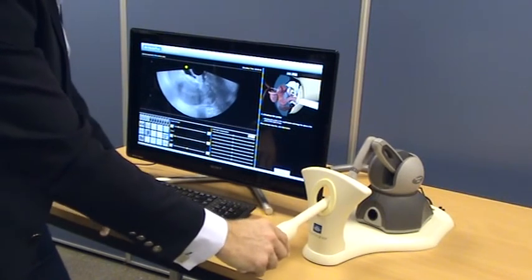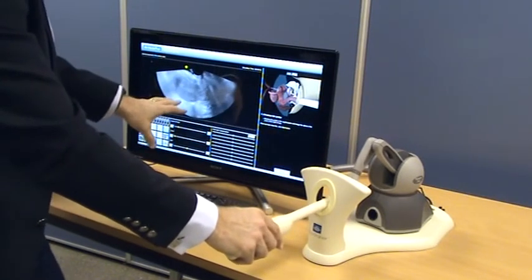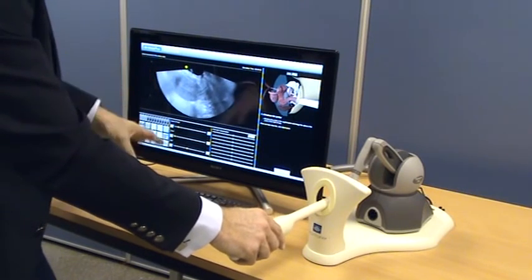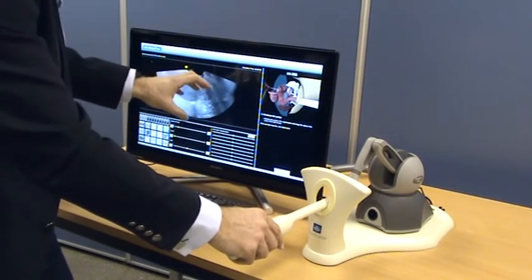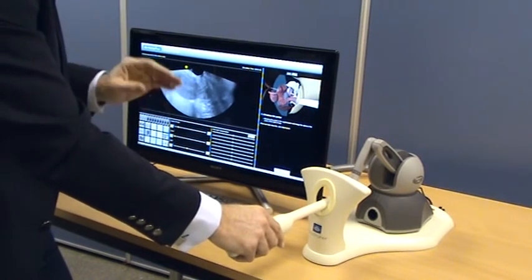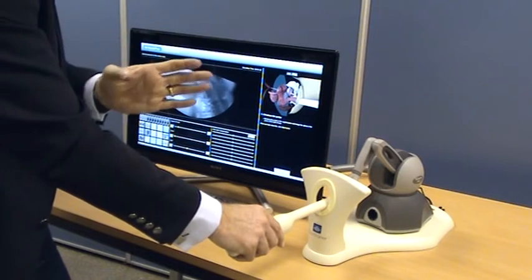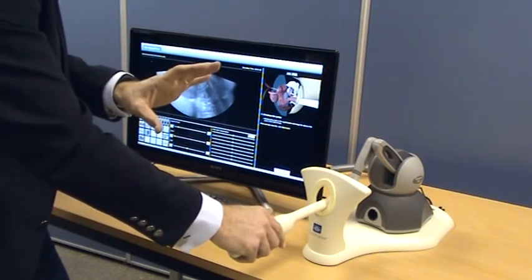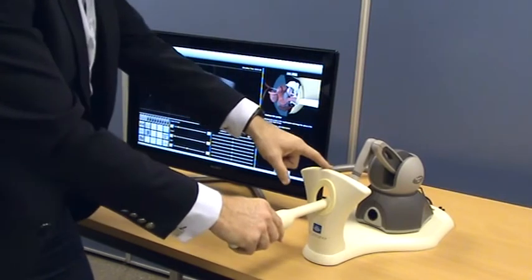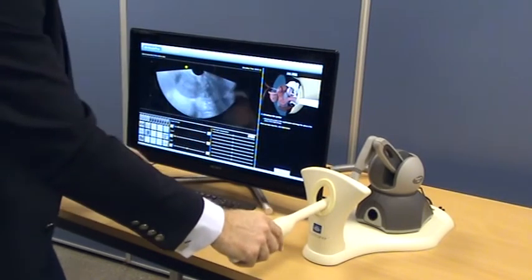Now this is a real patient scan, as I've said, that's built up using our unique novel software that enables us to perfectly replicate the patient's ultrasound scan. This is not a simulated scan, it's an actual patient where we've taken every slice of an ultrasound examination and then rebuilt it so it perfectly matches wherever this probe is within our virtual patient.